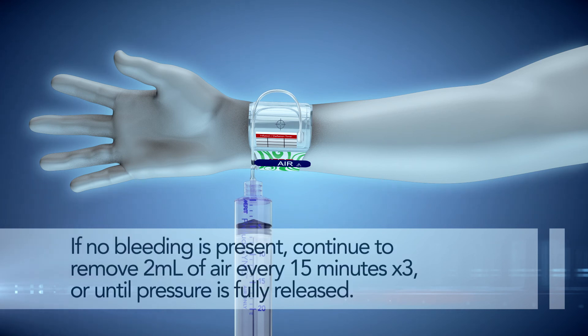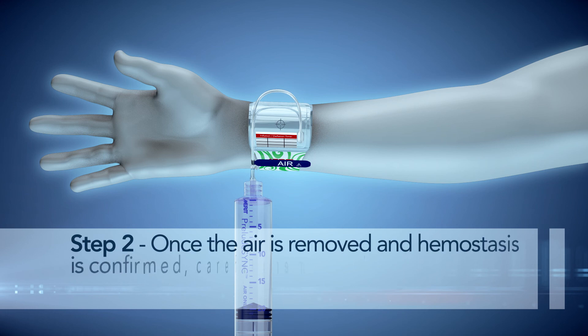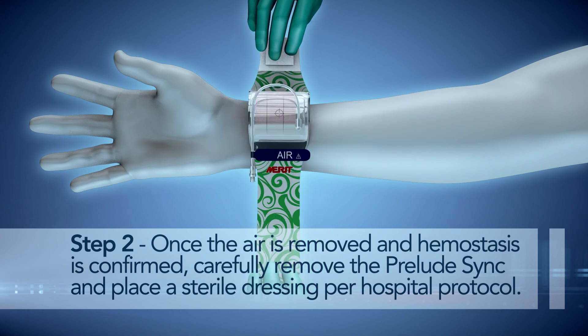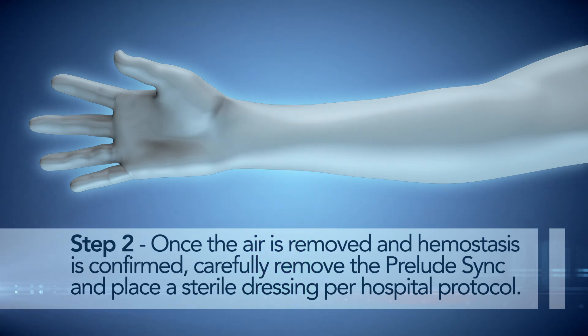If no bleeding is present, continue to remove 2 mL of air every 15 minutes, three times, or until pressure is fully released. Once the air is removed and hemostasis is confirmed, carefully remove the Prelude Sync and place a sterile dressing per hospital protocol.